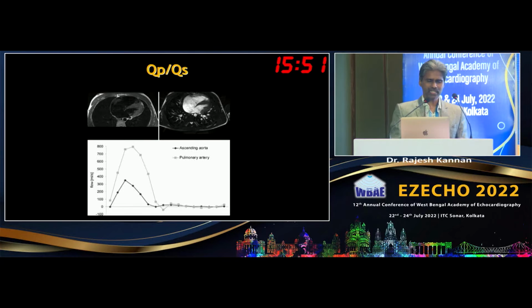Coming to the phase contrast flow study, one important method where we will use PC is for quantifying the Qp and the Qs in the case of a left to right shunt.